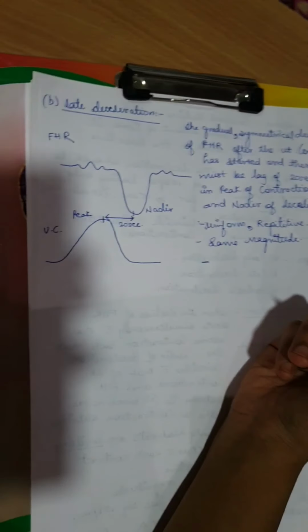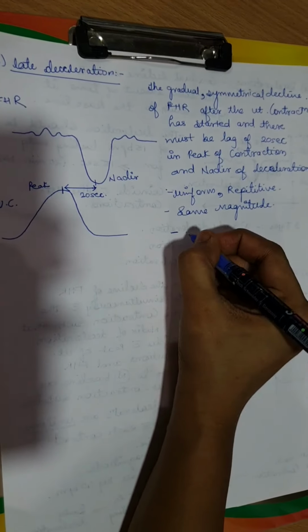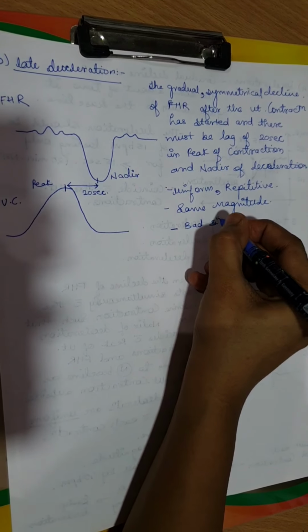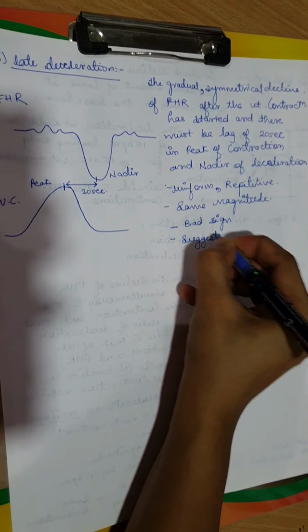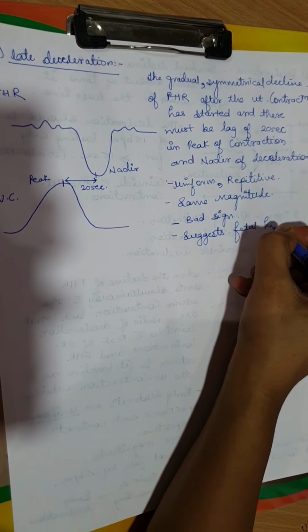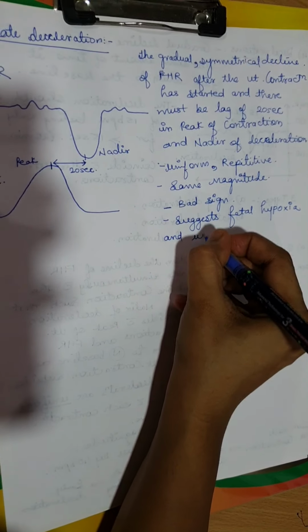Now, is the late deceleration a good sign or a bad sign? Yes, it is a bad sign. It suggests fetal hypoxia and uteroplacental insufficiency.